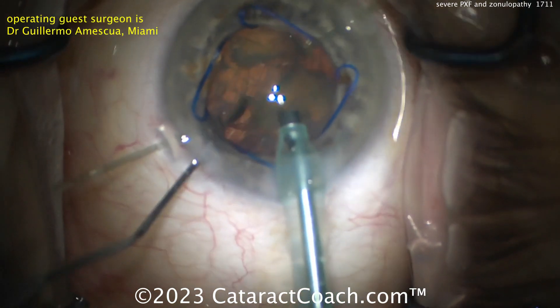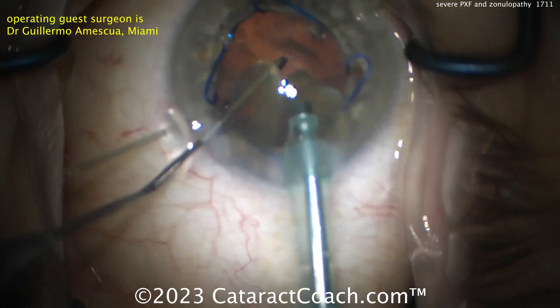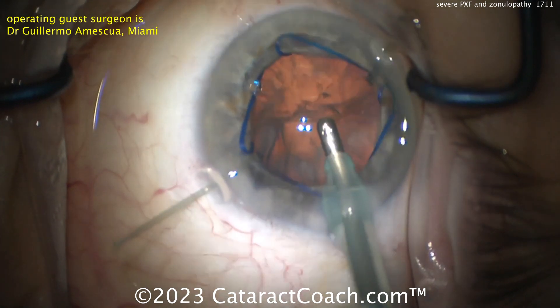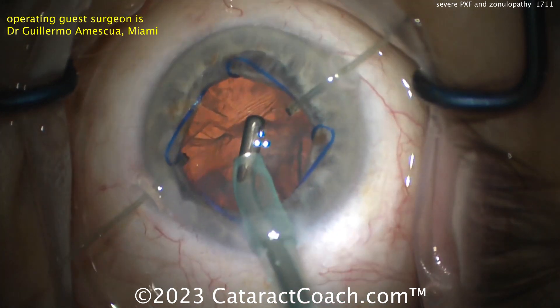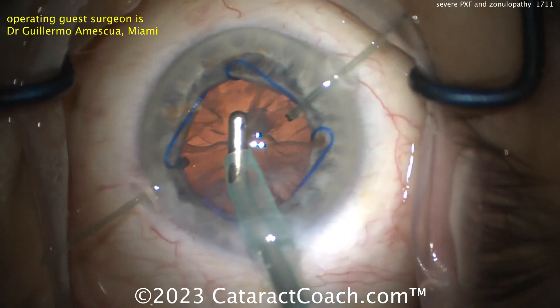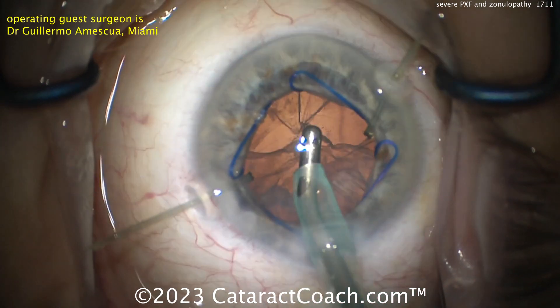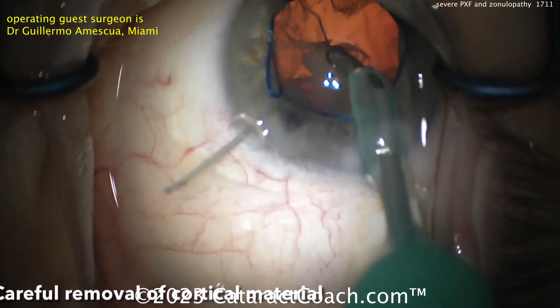If the capsule support is this weak, it begs the question: how would you put a lens in the eye? Are you going to put a lens in the bag? What I would normally do is a capsular tension ring in the bag, and then a three-piece IOL with the haptics in the sulcus and the optic captured through the capsule. Also take into consideration how old the patient is — if they're 90, you don't need the lens to last 20 years. But if the patient's 50 or 60, you need some sort of lens attachment to hold up for many decades to come.